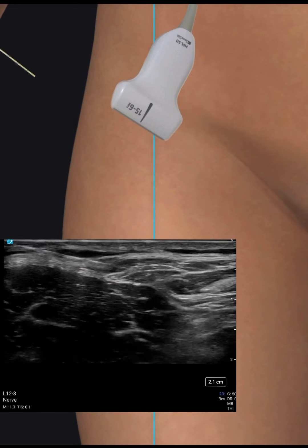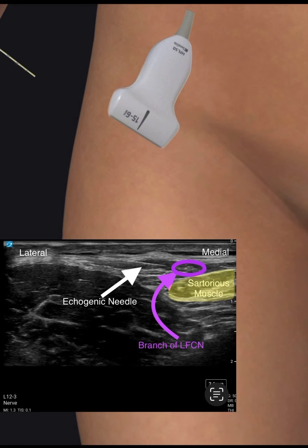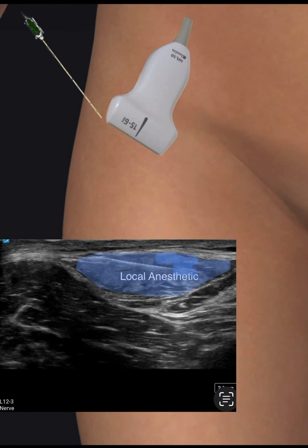For the block procedure itself, the lateral femoral cutaneous nerve is located. The block needle is inserted with a lateral to medial orientation using in-plane technique. 5–10 milliliters of local anesthetic is injected around the nerve.